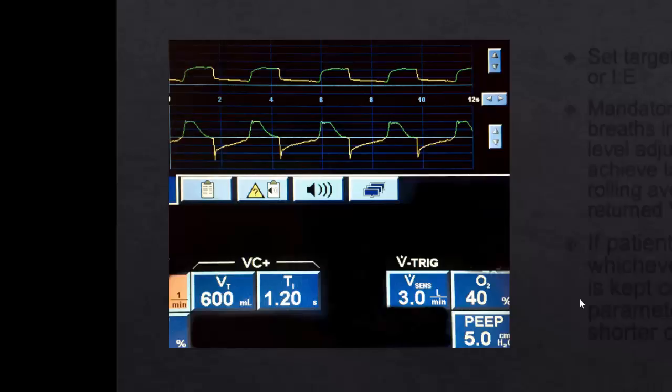They have some interesting modes of ventilation. And again, I really want to encourage you to take a break and stop the video right now. If you haven't followed most everything I said, you will get confused. But if you're with ventilators, you might want to stop the video now, try to review all of these modes up until now on rounds, and then come back to this video at this point, or if you ever see some of these fancier modes. But I want to talk to you about some of the modes that are very helpful. We've been switching to these more modern modes, mostly for patient synchrony and comfort.